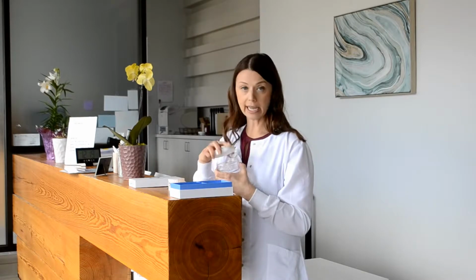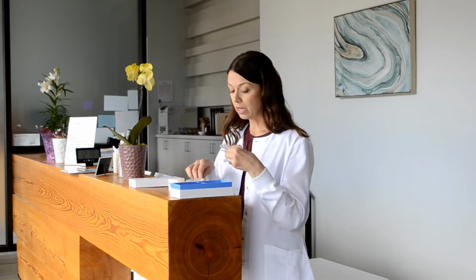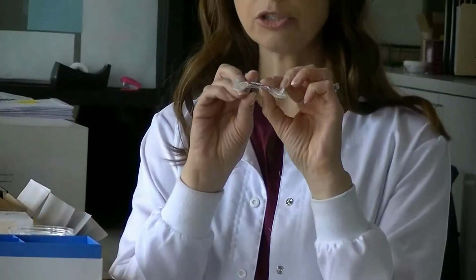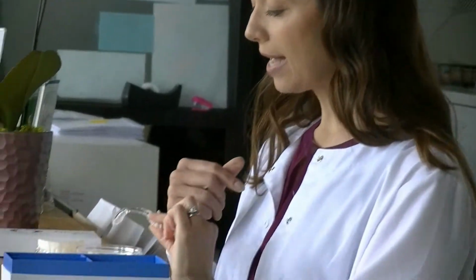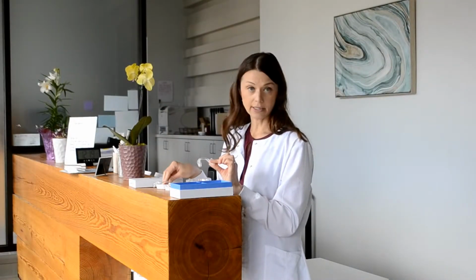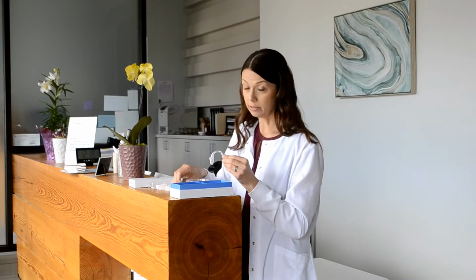If after 30 days of wearing this particular device, we do a screening for you or your physician does a sleep study for you, and we find that we've gotten better, but we still want to see if you can get maybe a little bit better than what we're at, then we're going to advance you 1 millimeter. And it's the same exact looking device, except for this one says L1. And we would just place that on the lower instead of the L0, still use the U0, and now we have 1 millimeter of advancement.